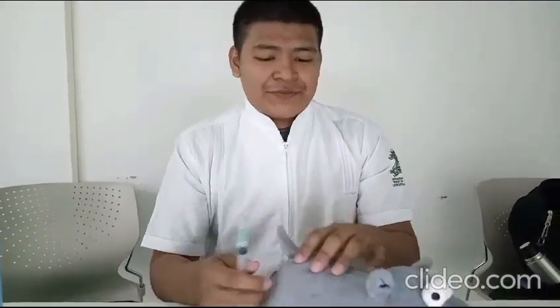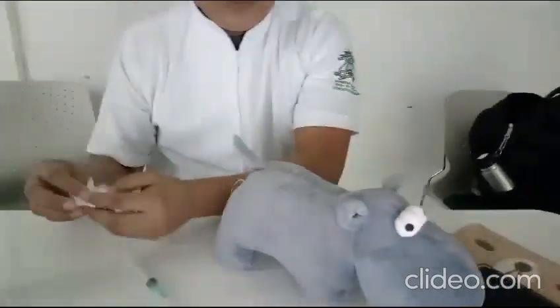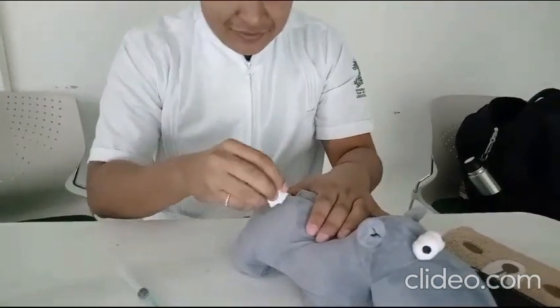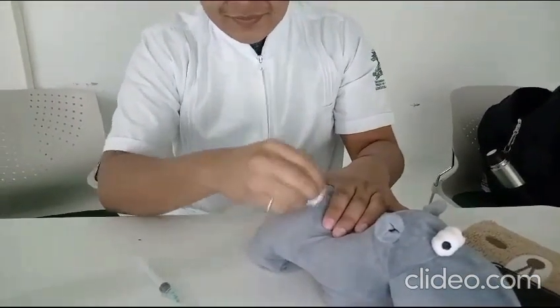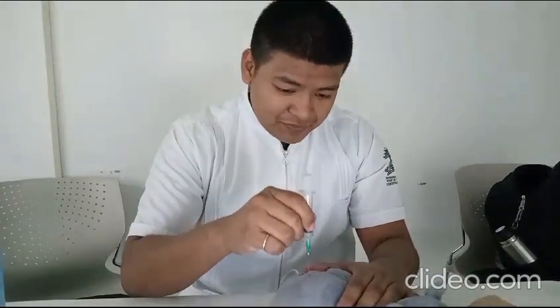You must identify where the injection will be applied according to the site to be chosen and clean the region with an alcohol swab. Apply the antisepsis. It is very important to extract the air from the syringe. You must delimit and puncture by positioning the needle at a 90-degree angle.